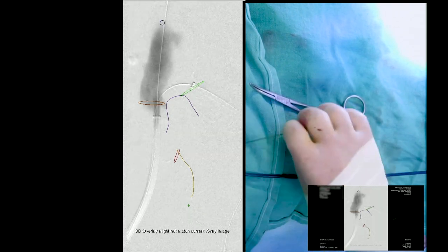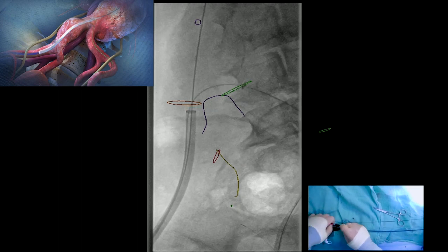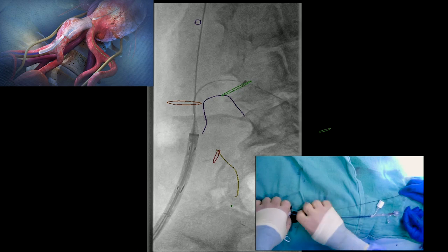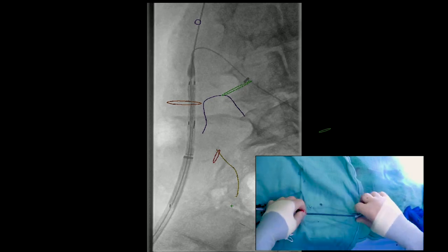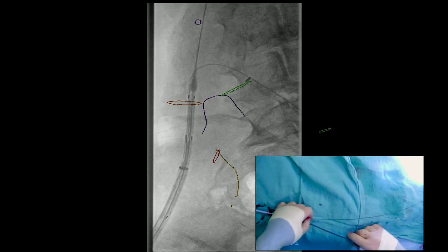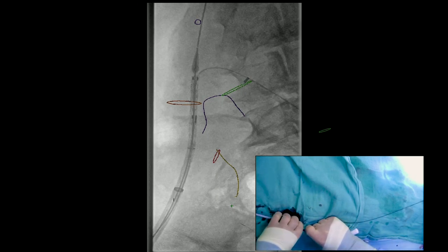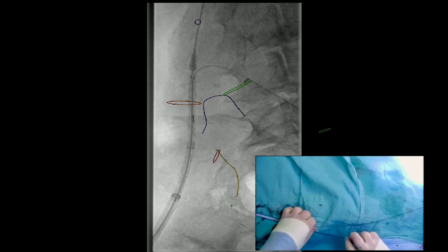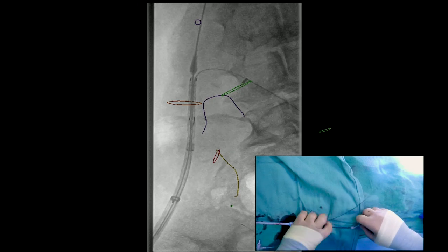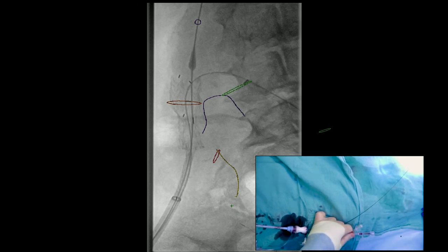We're advancing the endoprosthesis up over the dual wire. As it exits — some of this has been sped up — you'll see there's a wire wrap, so the stiff wire goes right through the main body. There's a separate port coming through the right side, and you can see that the wire is wrapped. If you turn it one direction it makes it worse, so you go 360 back and then another 180-360. What you want to see is that nice wire separation, meaning the long mark should be pointing towards the ipsilateral internal iliac artery. You want the port — the gate — to be high enough that you can navigate down through the side limb and actually access the internal iliac.